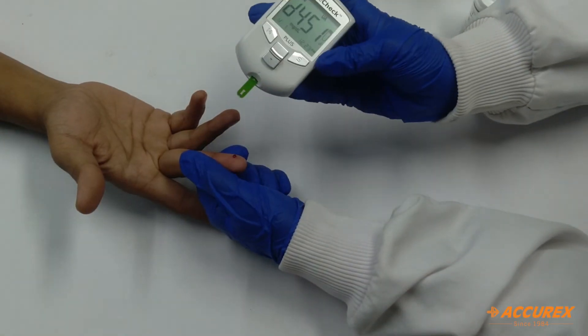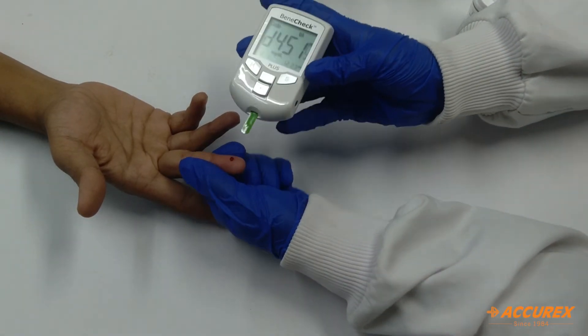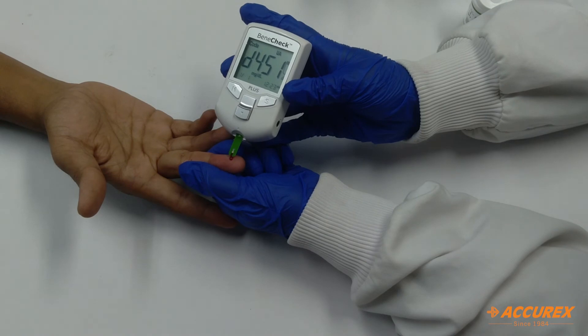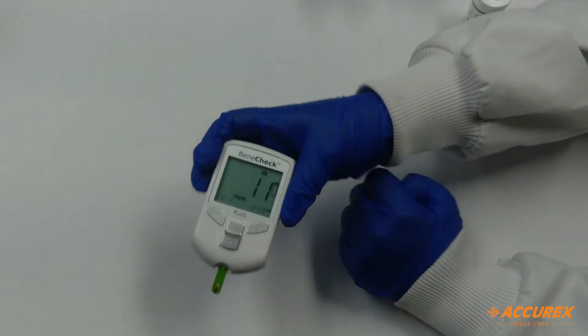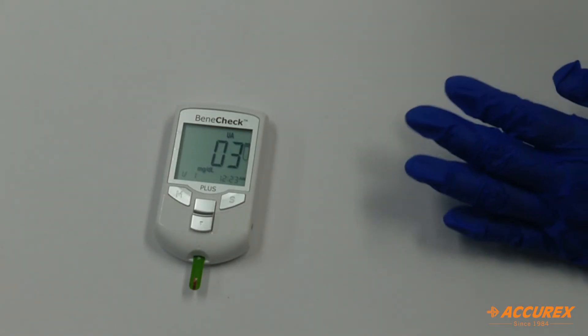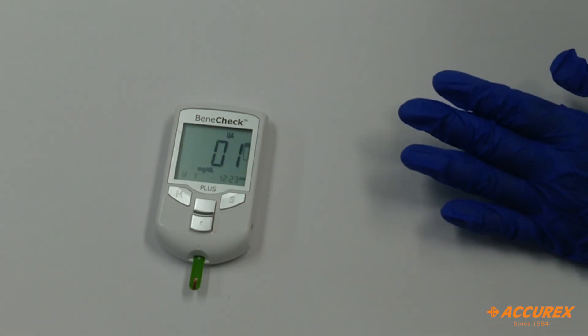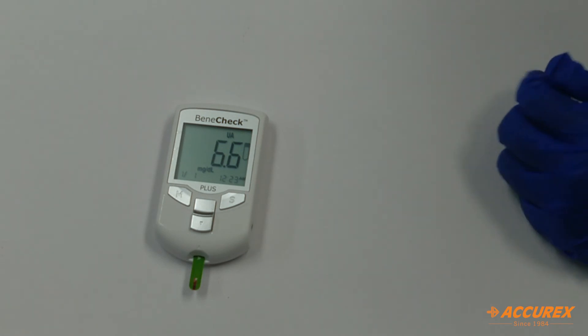We have inserted the strip in the meter. We will just place the strip on the blood and it will take 15 seconds of time to tell the result. After 15 seconds we will get the result for the uric acid level which is 6.6.